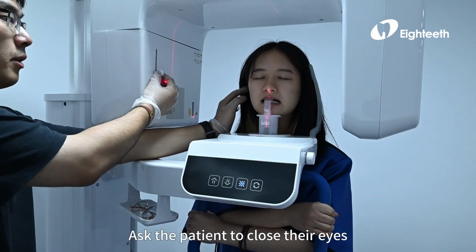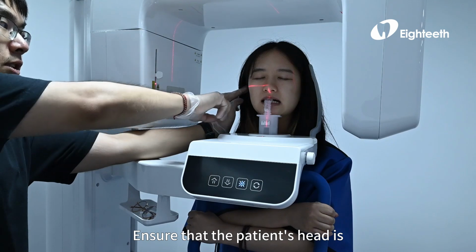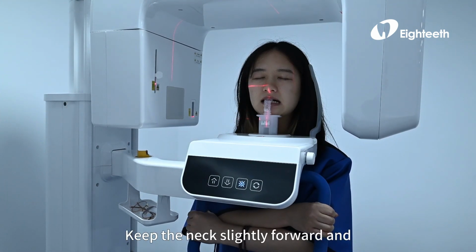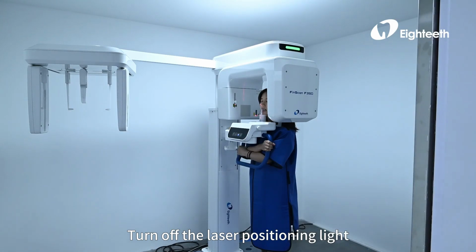Ask the patient to close their eyes. Avoid looking directly at the laser beam. Ensure that the patient's head is properly secured by the head support at the temple area. Keep the neck slightly forward and maintain a standing position. After patient positioning is complete, ask the patient to close their eyes before taking the shot. Turn off the laser positioning light.